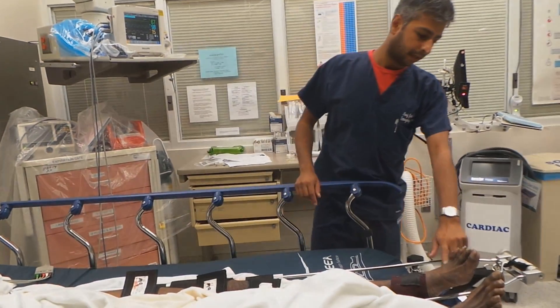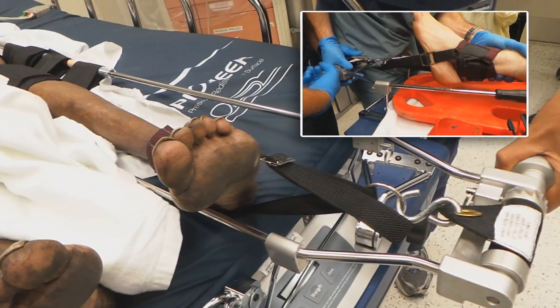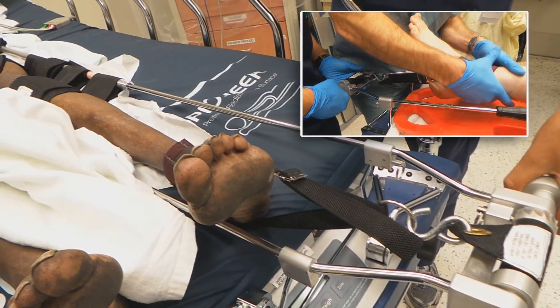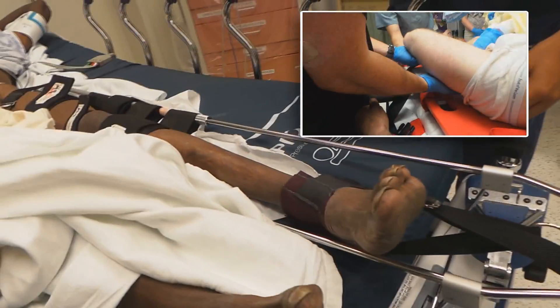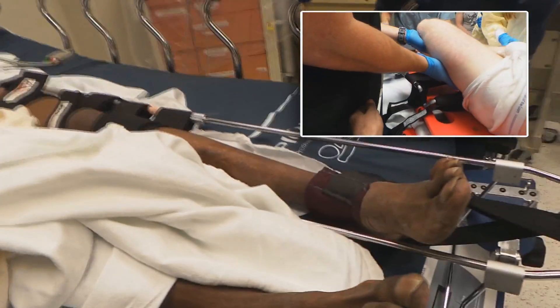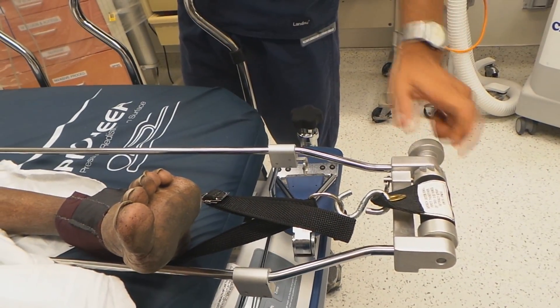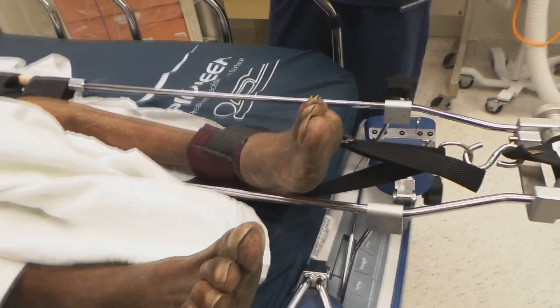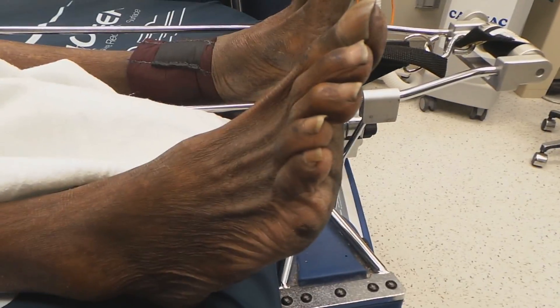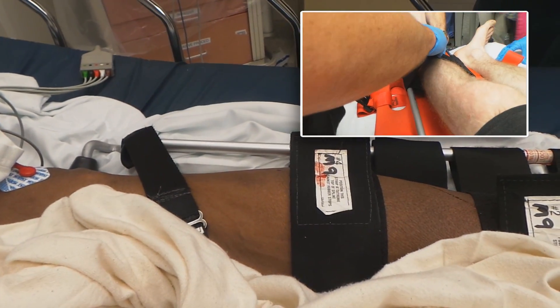You then connect the hitch to the traction mechanism and clamp this down. You do this until spasm is released, after you've slid it under his buttocks. Basically tighten this down until his leg is equal length with the normal leg and there's no spasm in his muscle. At which point you come in and close the three velcros that are over the middle of his leg.